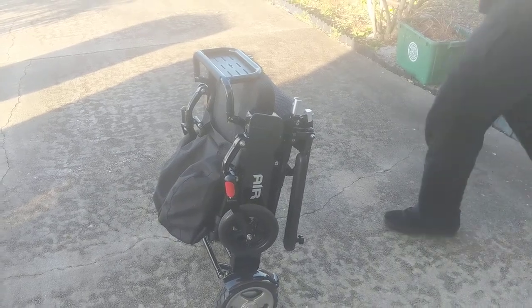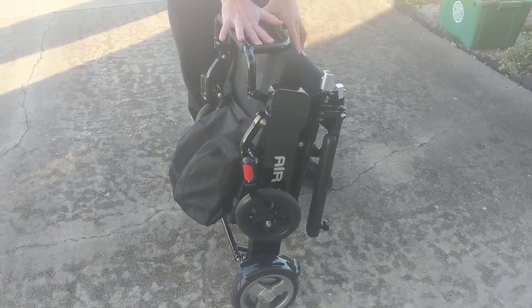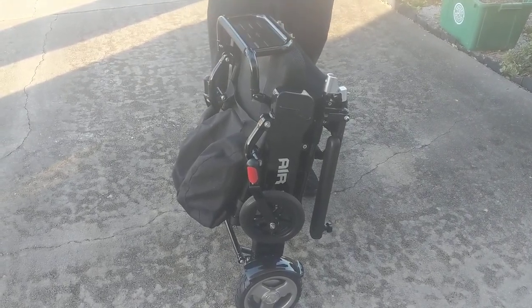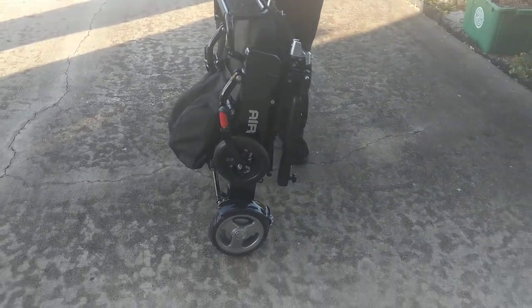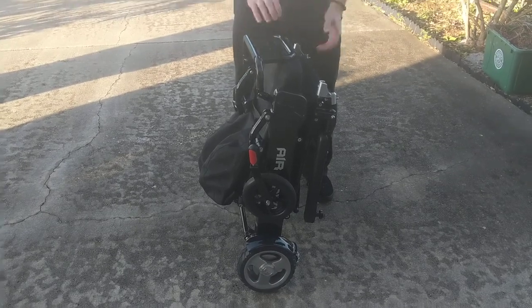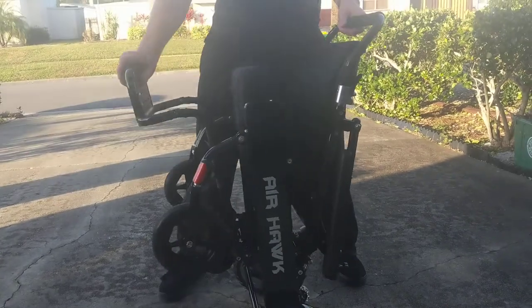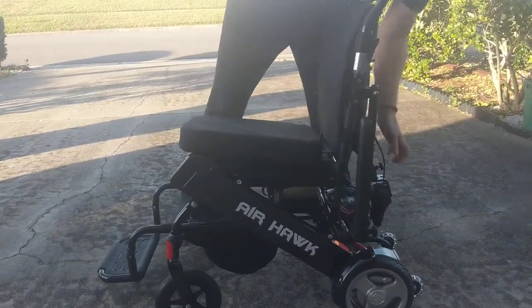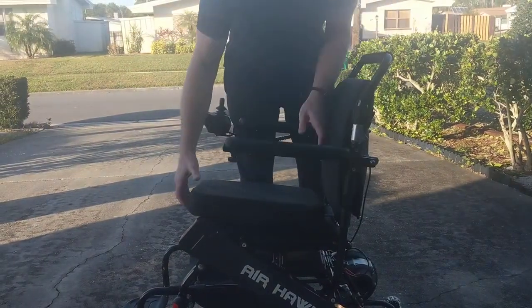In this video we're going to take a look at the Airhawk folding power wheelchair and show you how easy it is to put the Airhawk from electric mode or power mode into manual mode or push mode. First and foremost, let's go ahead and unfold the chair. This takes a couple of steps — we have several videos that depict exactly how to unfold the chair.